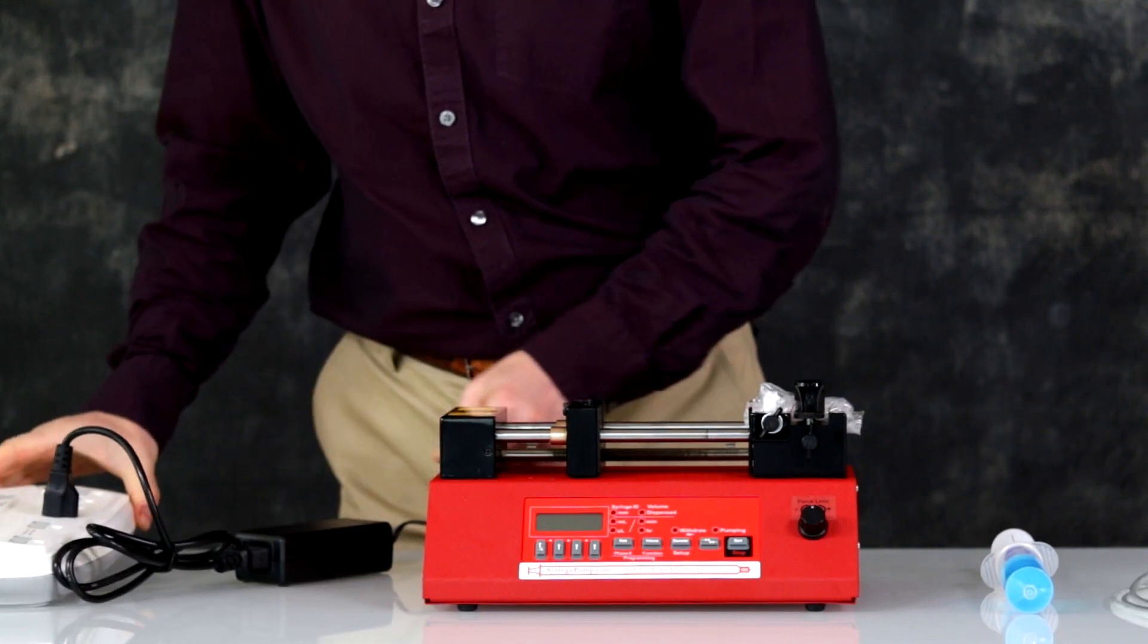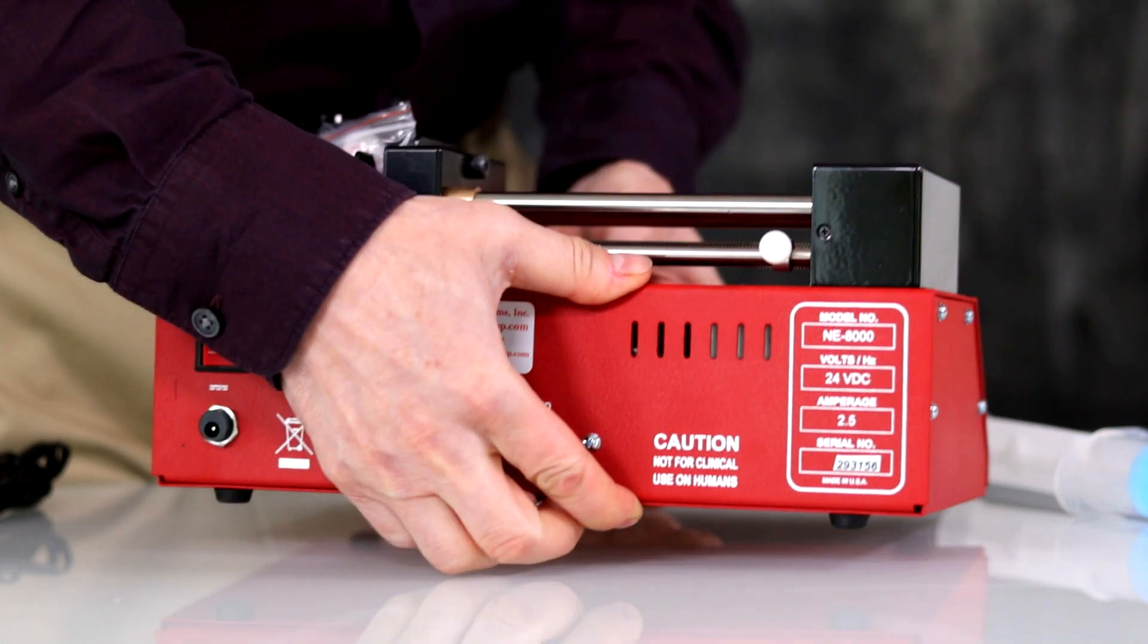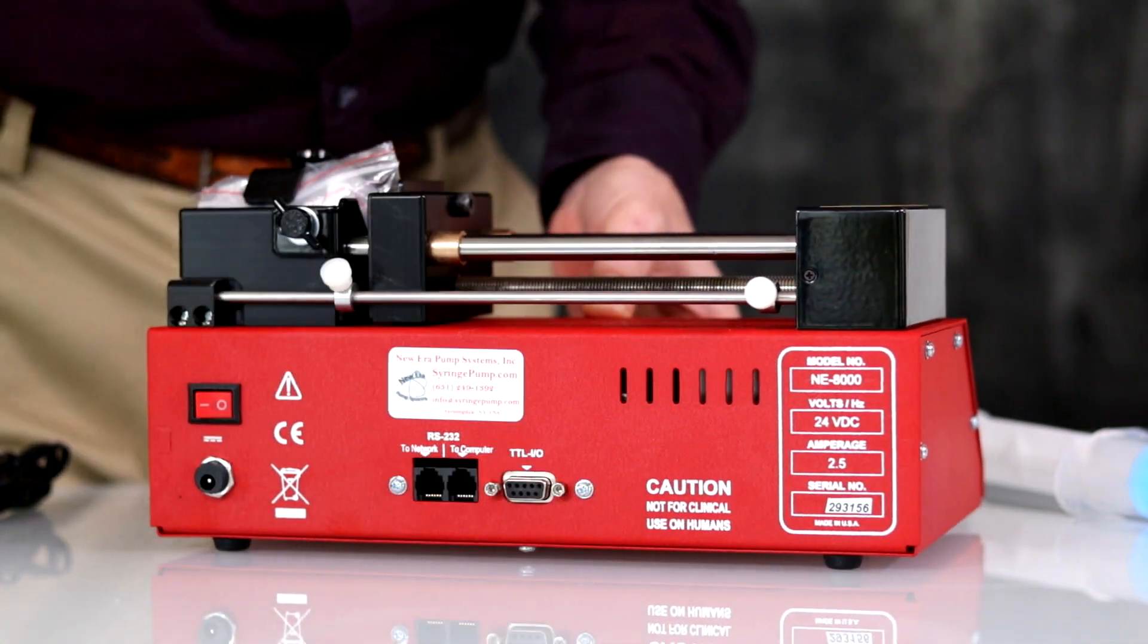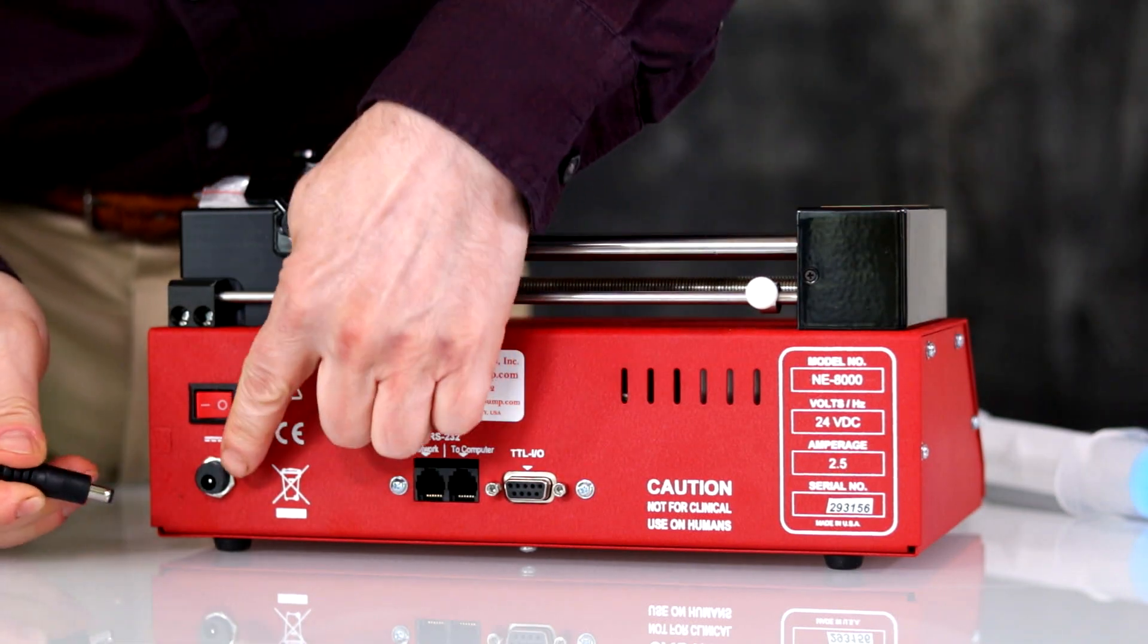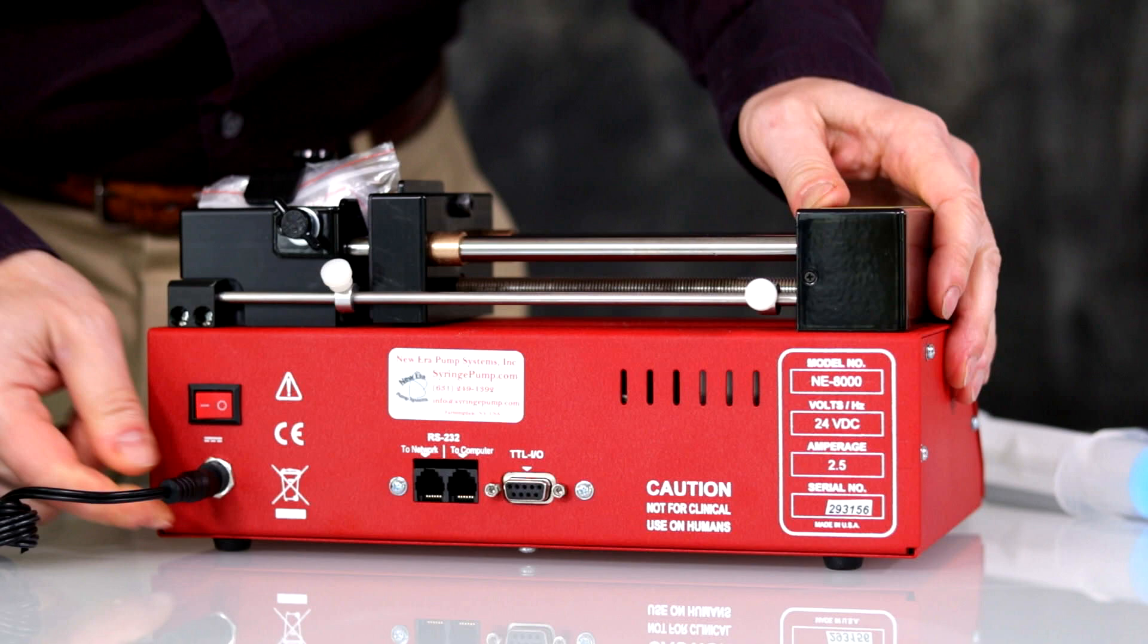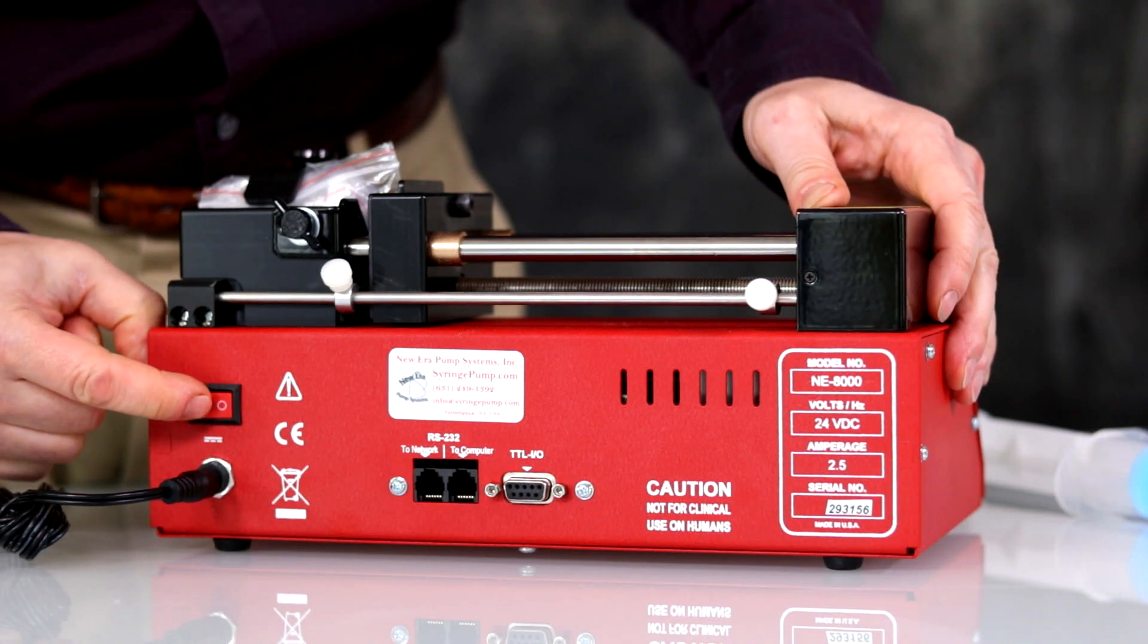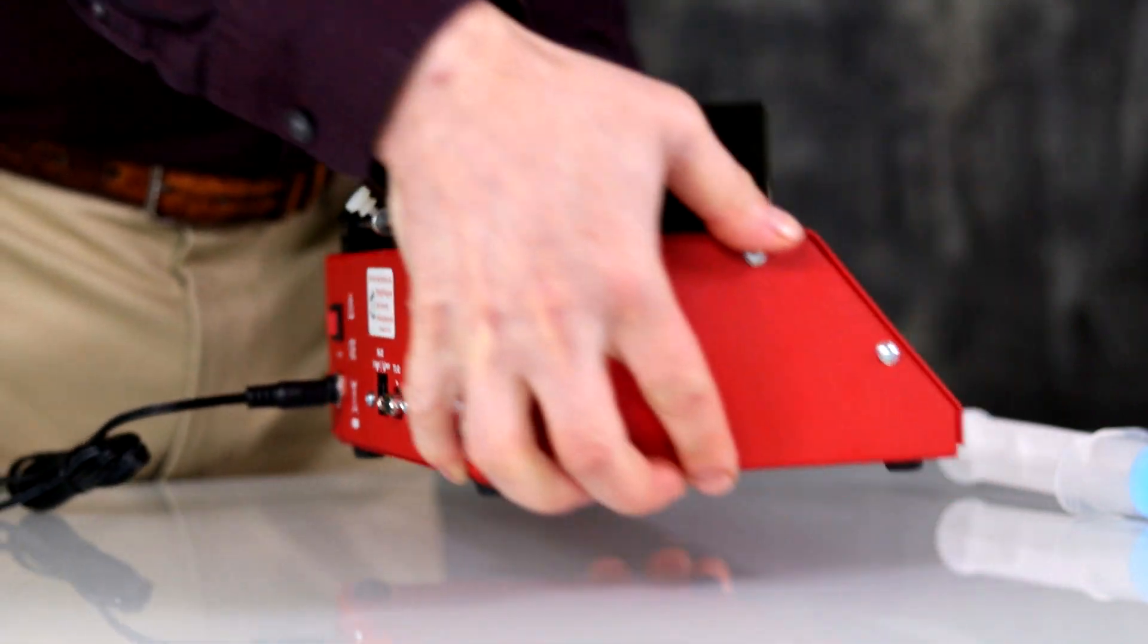Plug your power supply into the back of the pump using the round connector, then turn on the pump by pressing the switch. You will hear a beep indicating the pump's power is turned on.